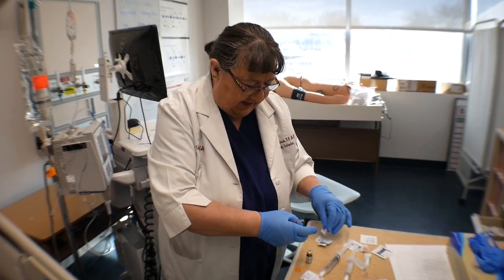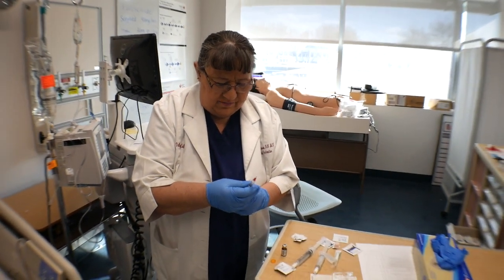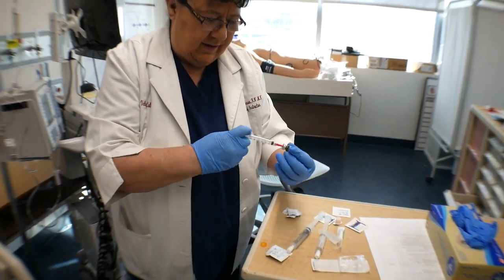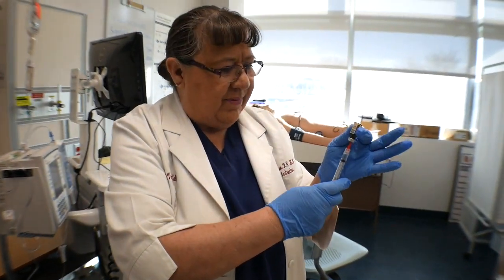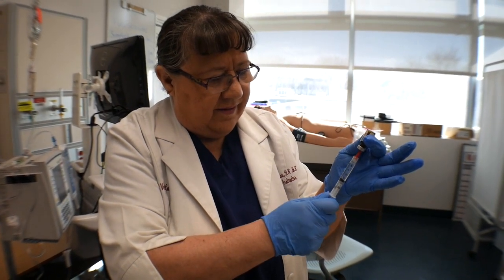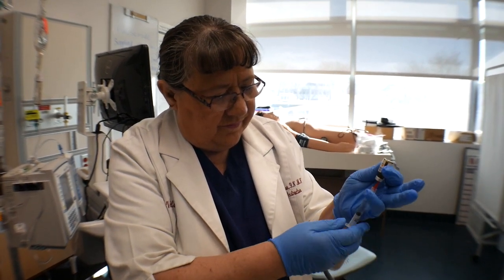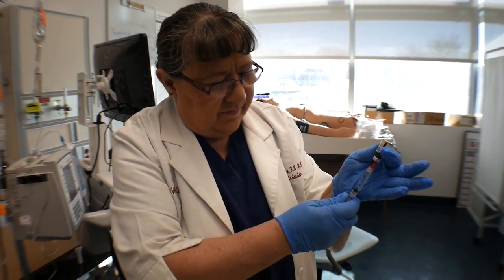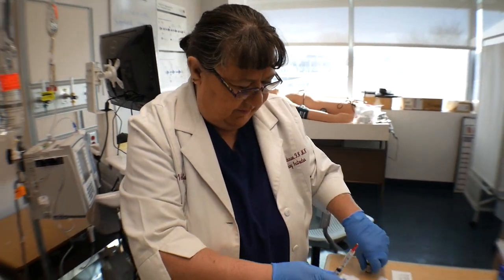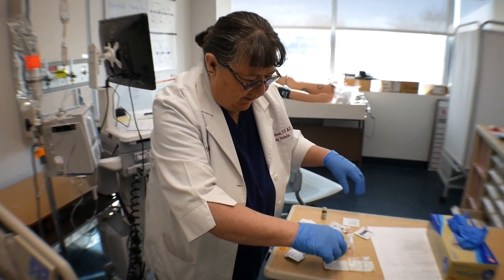So since this is a vial, I'm going to be drawing up 2 milliliters. Air to air, and then flip it up and draw the solution. You always want to scoop and not recap.